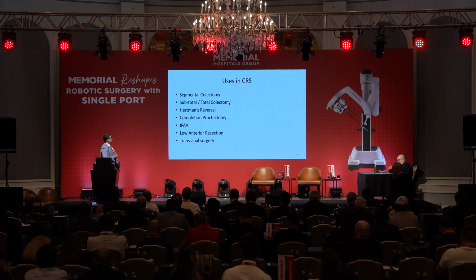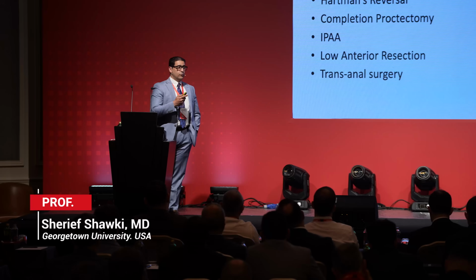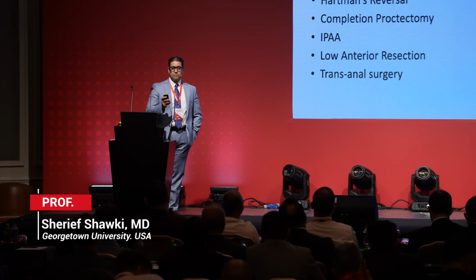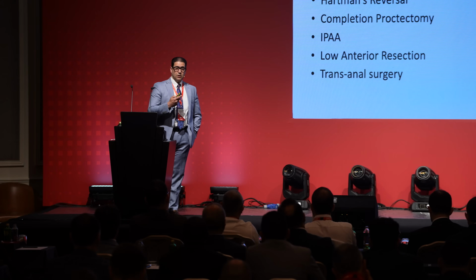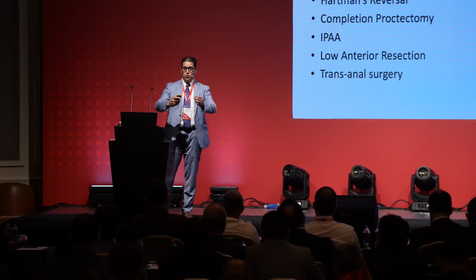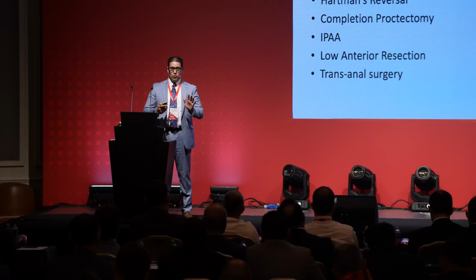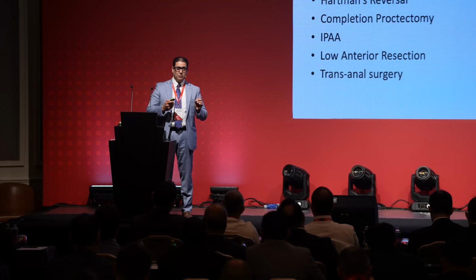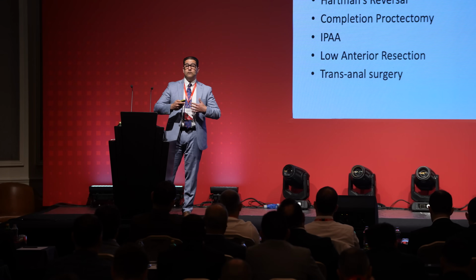So uses in colorectal surgery include whatever is on this list, but when you start implementing it, you need to implement it in a procedure that you are very, very comfortable with. In my mind, try sigmoid colon first, better than right colon. Try even an appendectomy just to get used to the ergonomics and how to move, and trust me, you will struggle in the beginning. It's okay. Don't give up hope. The idea is not to do the appendectomy. The idea is a small procedure that you can do safely to get used to the new vehicle so you know how to drive it.